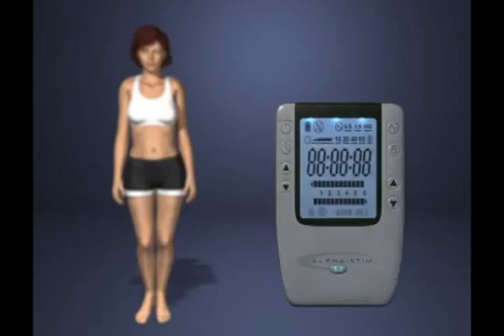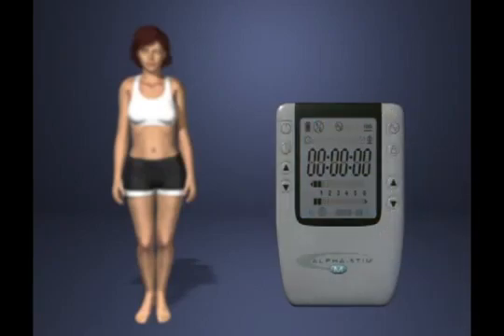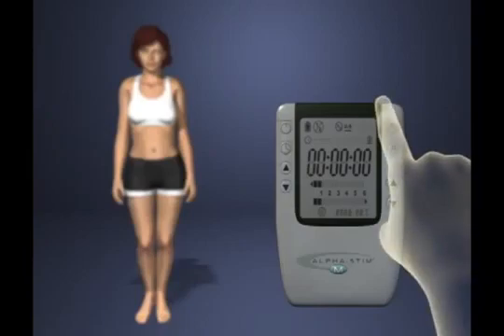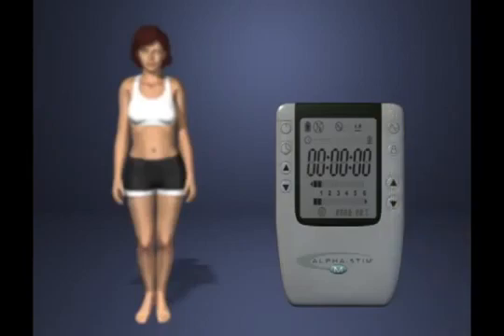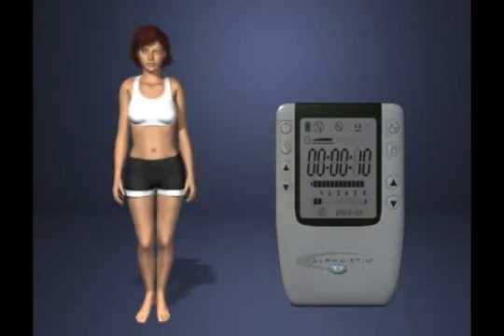Press power on. Set frequency to 1/2 Hz or desired setting. For joint problems such as shoulders, elbows, wrists, fingers, hips, knees, ankles, or toes, use 100 Hz for 10 to 20 seconds, immediately followed by 1/2 Hz. Try 1.5 Hz if 1/2 Hz is not effective. Set timer to probe setting. Set current on the channel in use to 6, which is 600 microamperes.